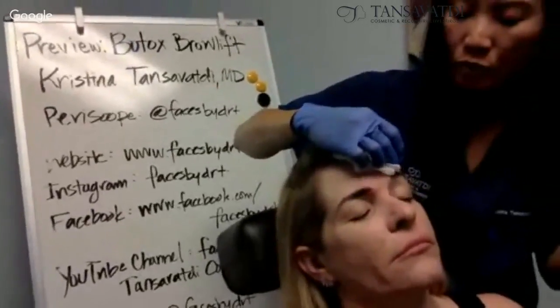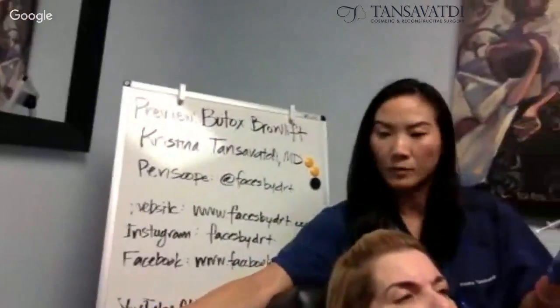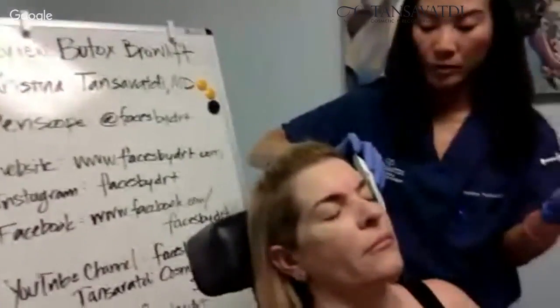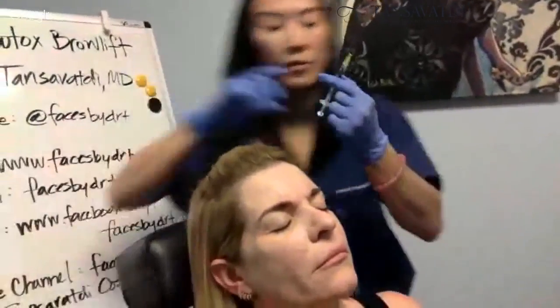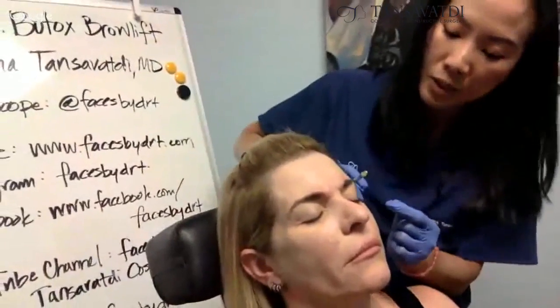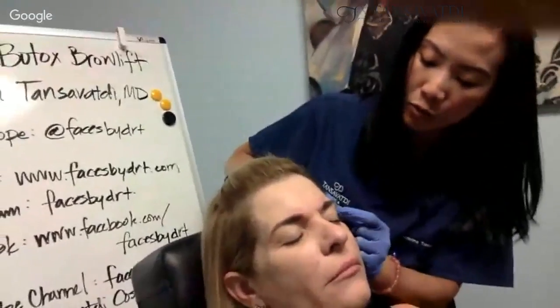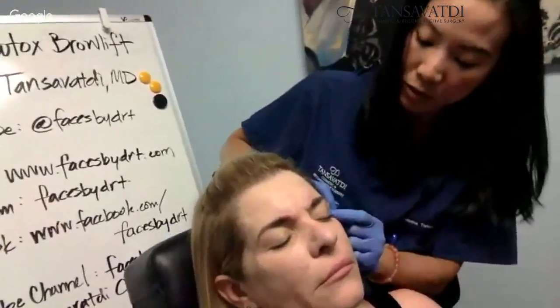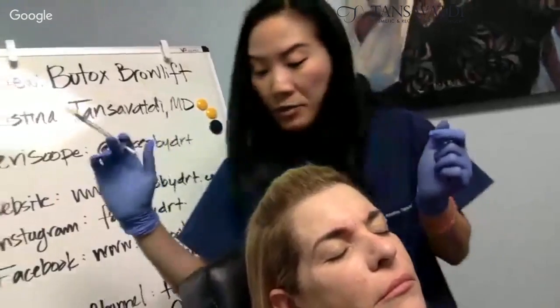Now I'm going to do the outside of her brows. Squint. Relax. So this is a portion of the orbicularis, and a little bit lower too, even, and just get a little bit of the crow's feet with that. That was that injection.